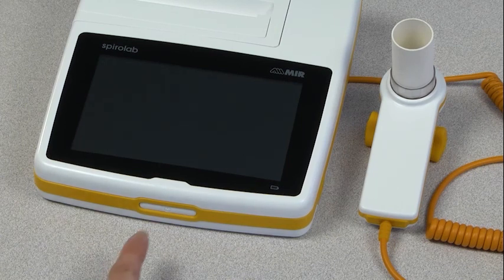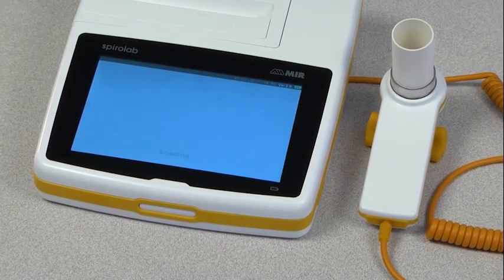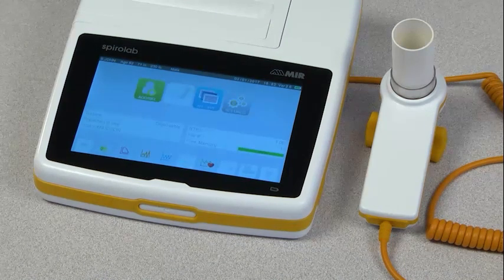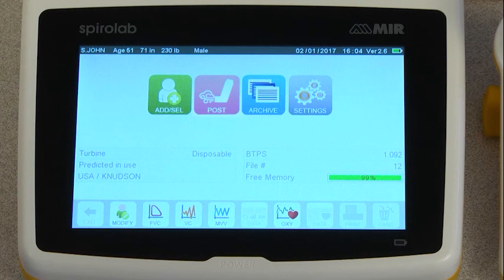The power button is located on the front of the SpiroLab. Press it to turn the device on. This will bring you to the home screen, where you will see icons that allow you to add or select a patient, conduct a post-test, retrieve results from the archive, or adjust the settings of the spirometer.